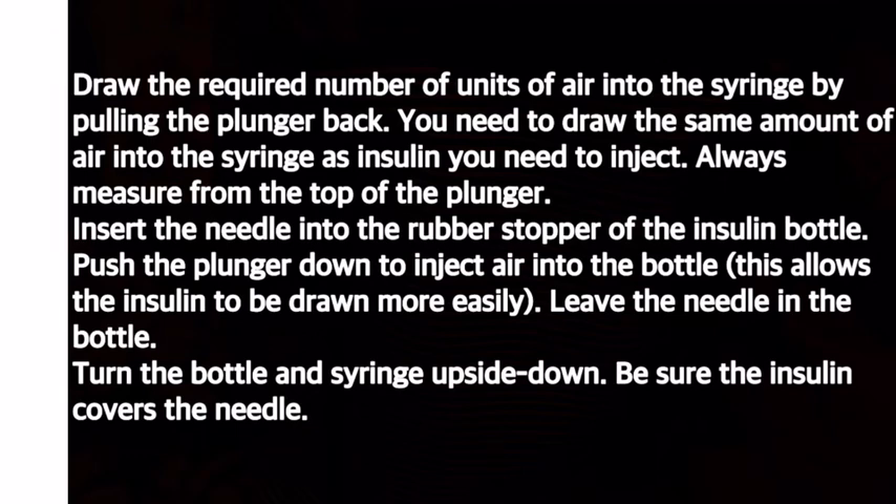Insert the needle into the rubber stopper of the insulin bottle and push the plunger down to inject air into the bottle. This allows the insulin to be drawn more easily. Leave the needle in the bottle, then turn the bottle and syringe upside down. Be sure the insulin covers the needle.